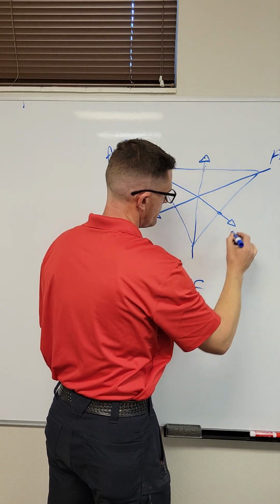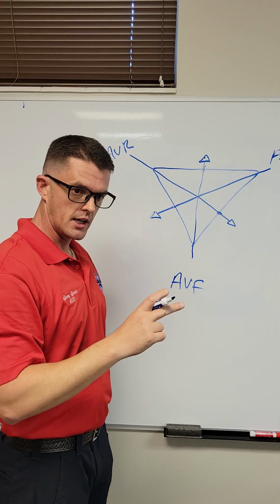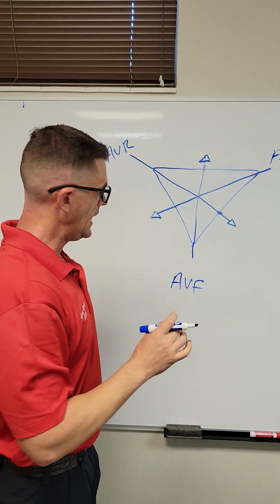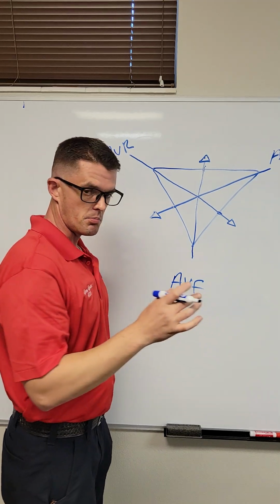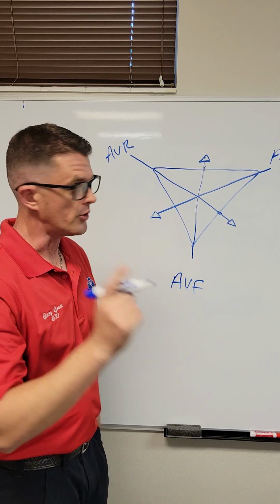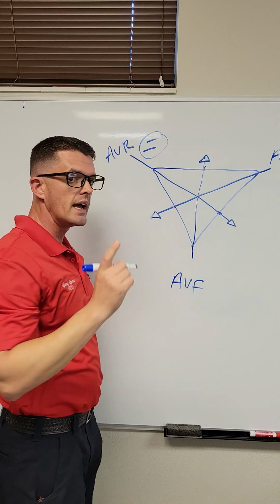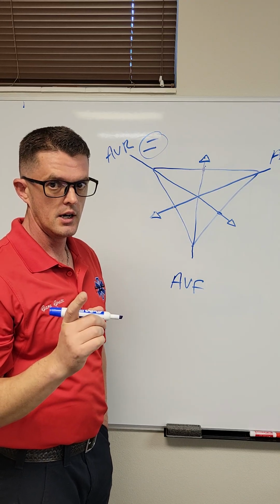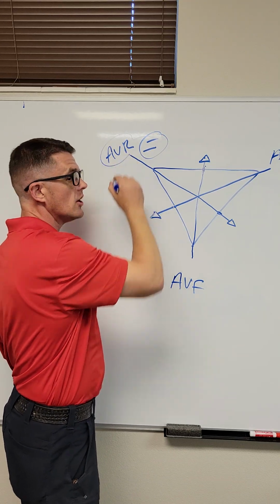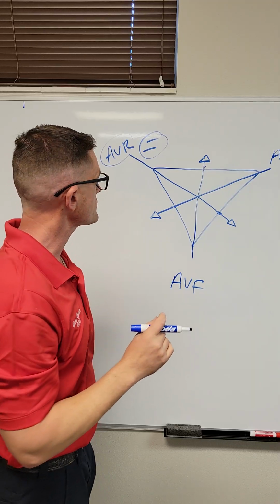And there you go. Now you not only have bipolar leads, thank you to the Einthoven Triangle, now you have augmented vector leads, which are positive leads. Okay, don't confuse that. Be careful, because this is always listed up here as the double negative bipolar, okay? But technically AVR is positive. So that's where it does get a little confusing.